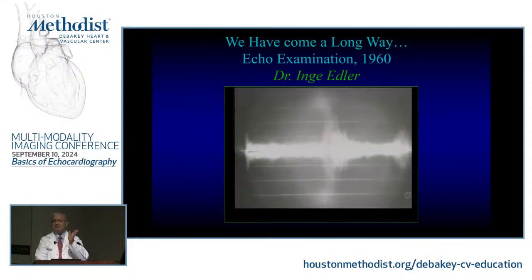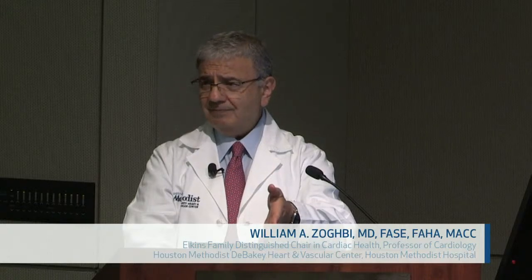The amazing thing to me is the principle has not changed. The principle is just tiny wavelets that you're sending and getting back. And it's the transducer technology and different questions. The first question was, can I see how far it is? How does it move?